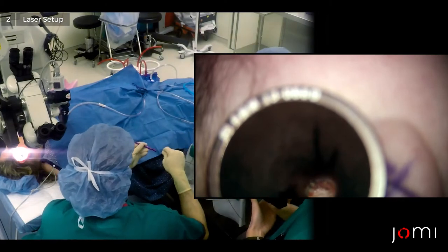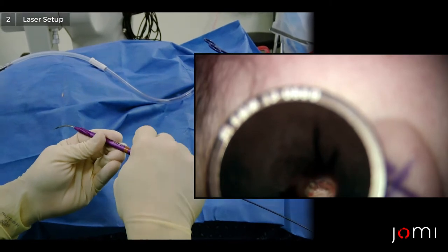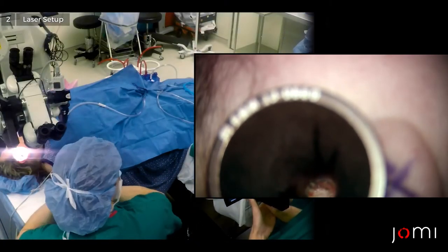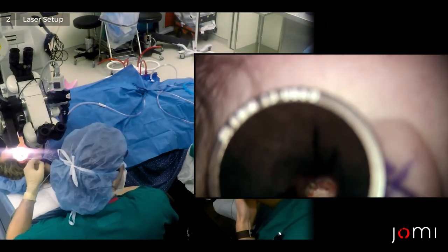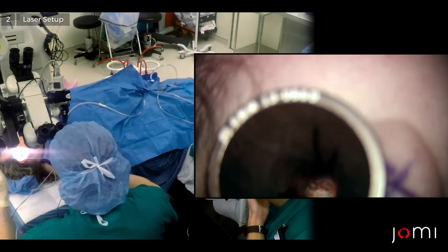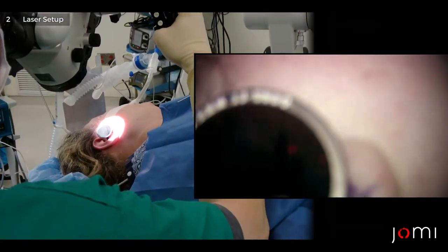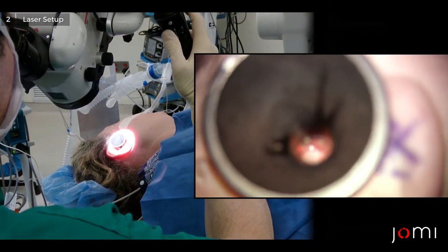Extend it out and tighten it down. We set it at 2 watts for 100 millisecond pulse duration — so very low power — single pulse.